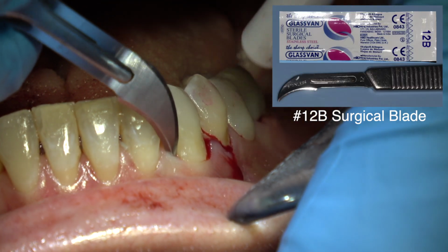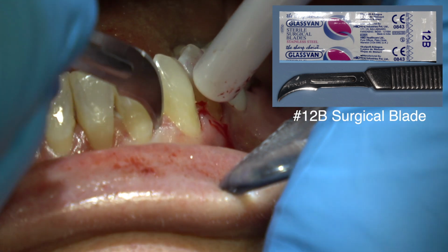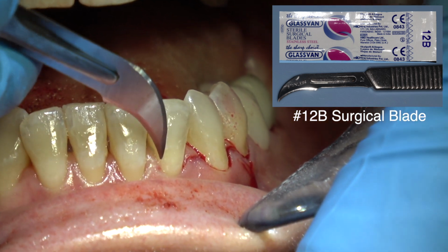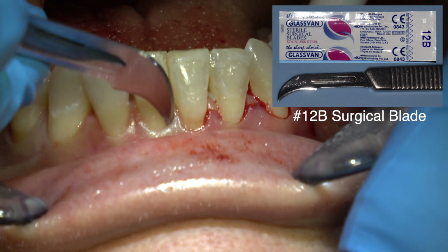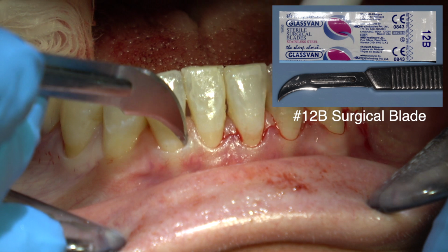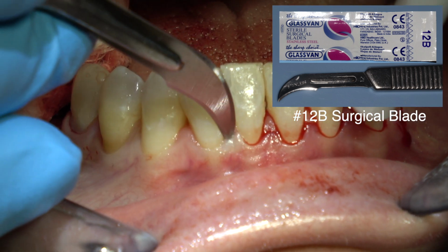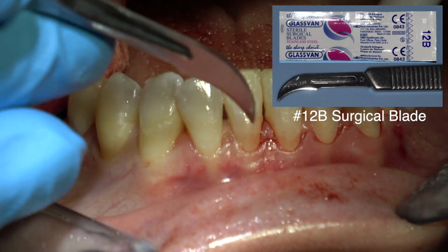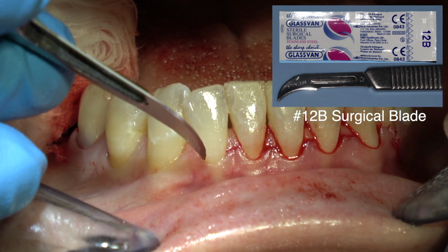This is a number 12 Bard-Parker. And you're not removing the papilla. You're going to suture into the papilla. You don't have to use a full thickness flap. It's actually ideal if it's a split thickness flap, but if the tissue's this thin, that's not an option because it's so thin you can't separate it into a split thickness, so you're going to reflect a full thickness flap.